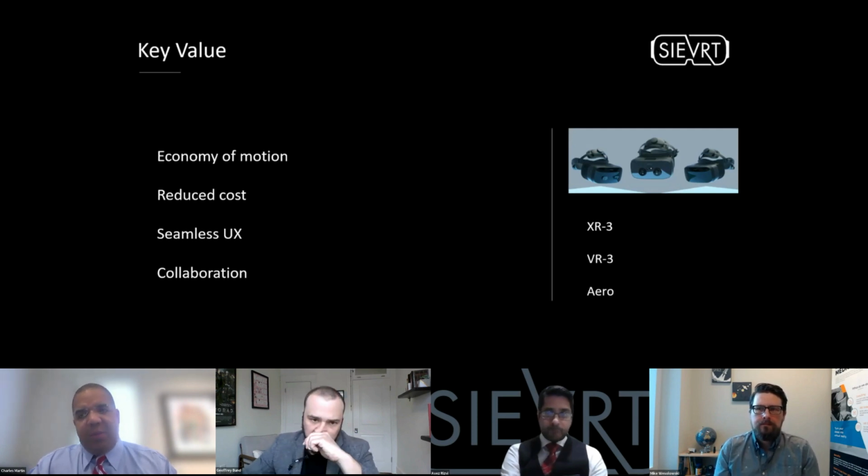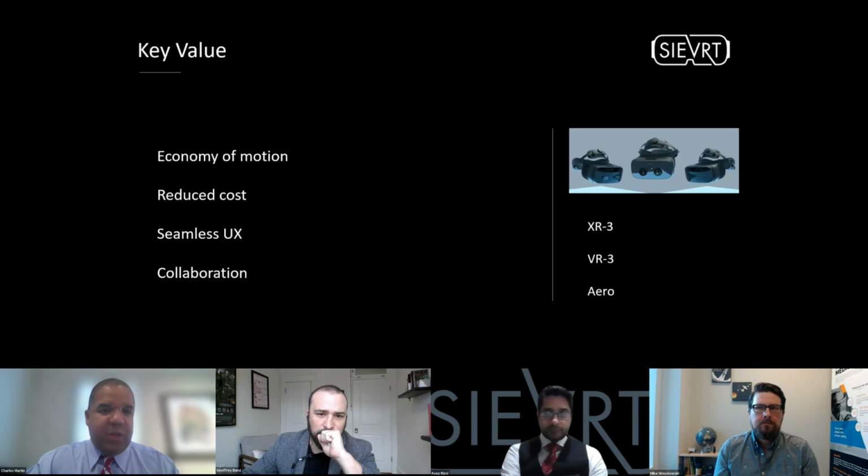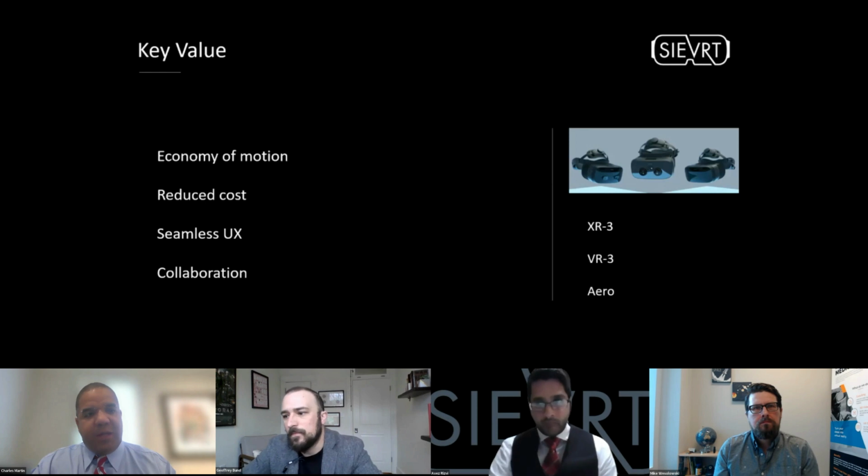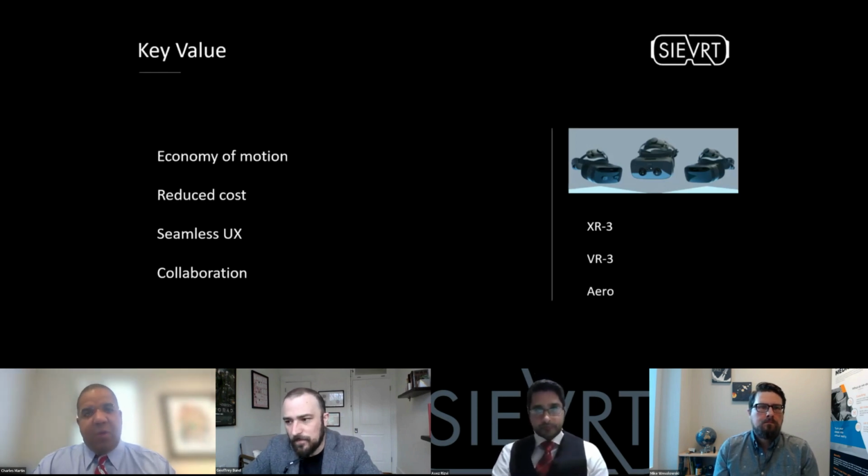Well, I think the higher resolution is going to be key. The screens that we use currently, not only do we have multiple screens, but the monitors are of a pretty significant resolution already. In addition, a normal reading room has to be of a reasonable darkness, to allow a diagnostic radiologist or even an interventional radiologist to ideally interpret the images in the most appropriate manner. And given that we were fortunate enough to use systems that had such a high resolution, I thought it was ideal in our current study to introduce it in this capacity. And I think that's been pivotal towards us getting such positive feedback so far, preliminarily.